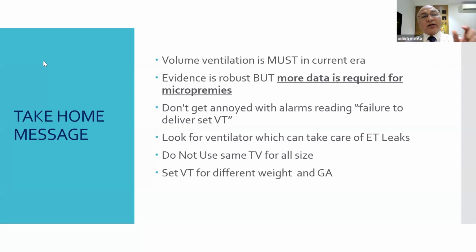But again, it is not the number. You are looking at the baby, you look at the loops, you look at other numbers also. Not only one tidal volume number. That is what I will say.